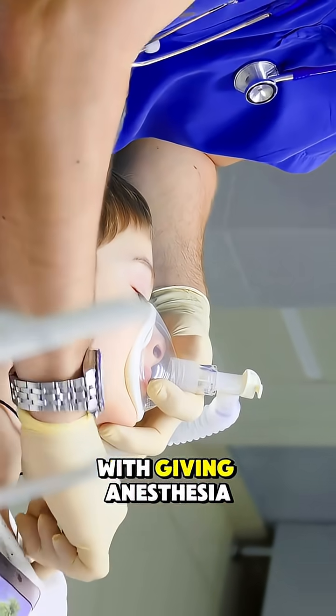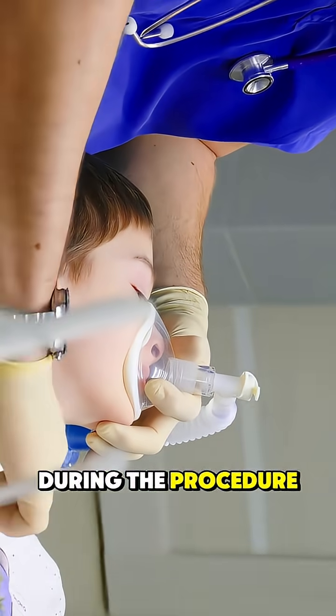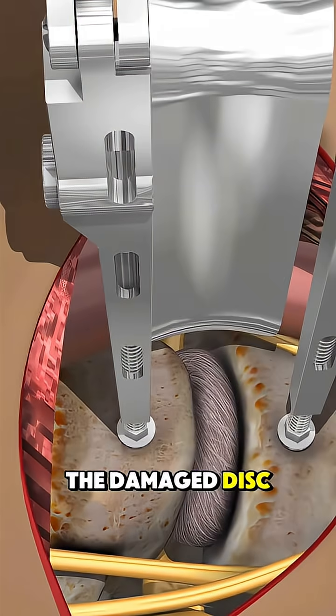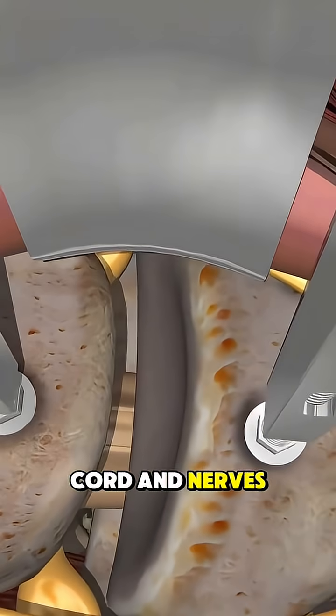The process starts with giving anesthesia so the patient stays asleep and pain-free during the procedure. The surgeon makes a small cut in the front of the neck to reach the spine. The damaged disc is carefully removed to take pressure off the spinal cord and nerves.